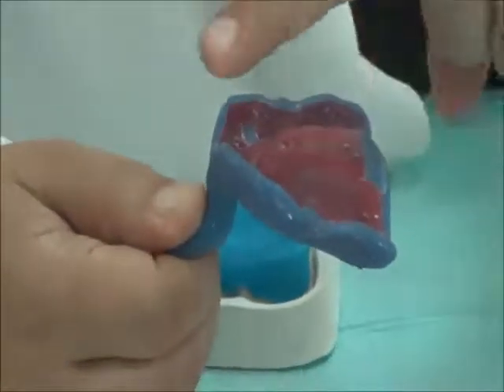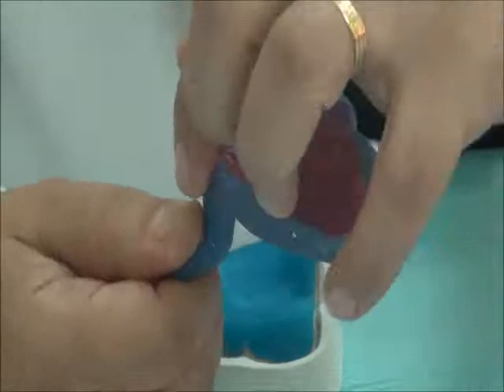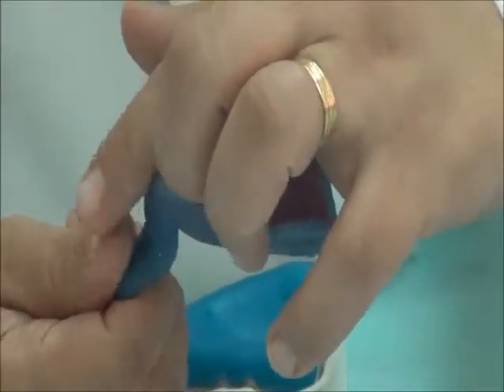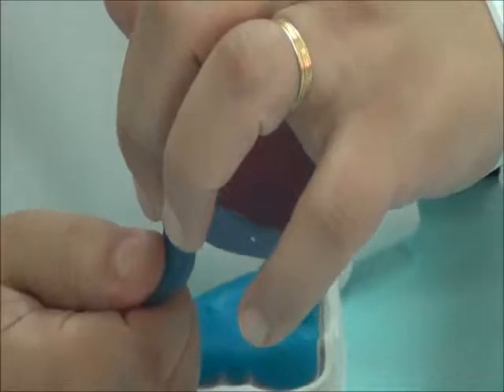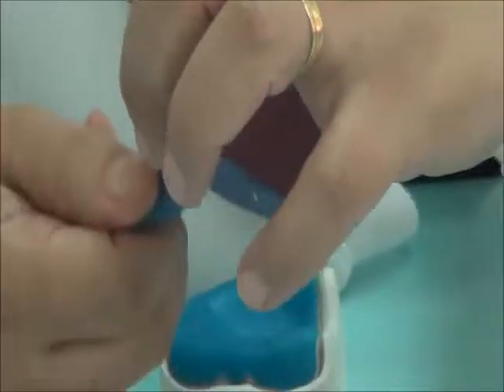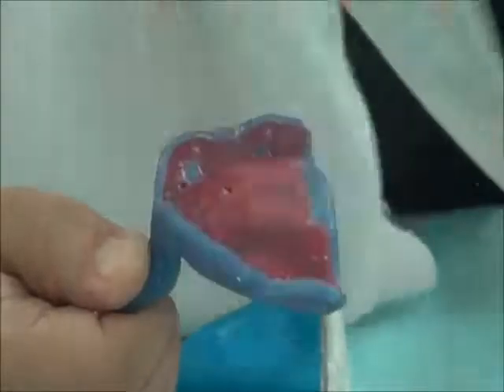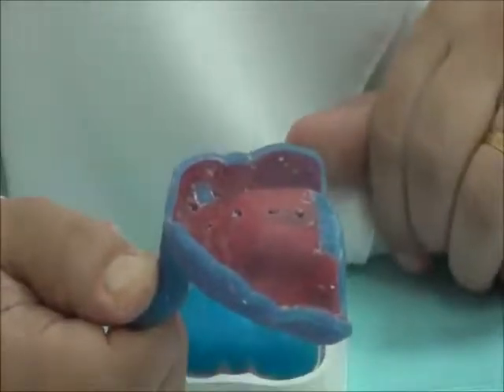If the lip is inside the patient's mouth and the lip is here, you can notice that the lip will be resting without any distortion or movement. So I could hold my tray, insert it, and take it in and out without distorting the lip. This will aid in an accurate impression as well.